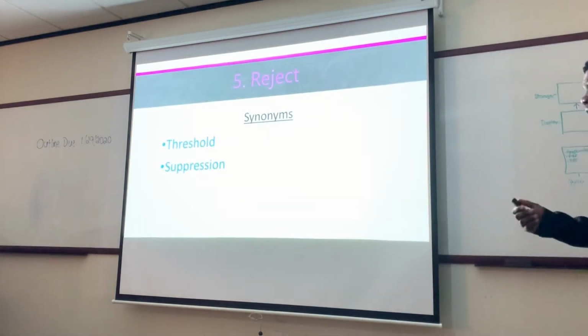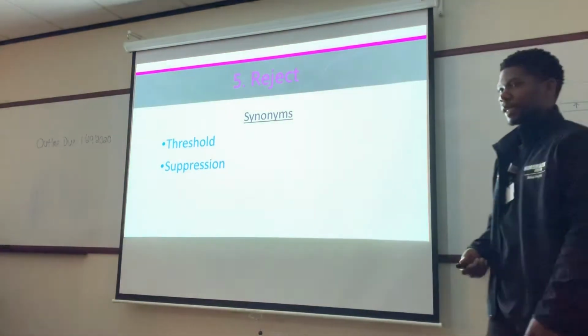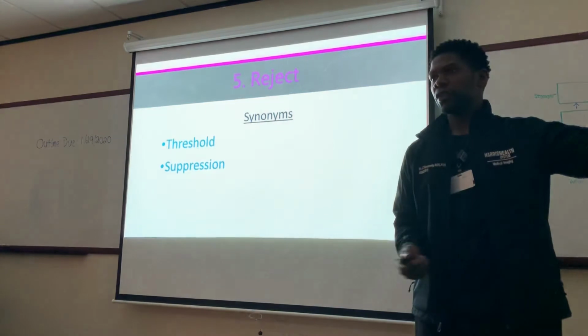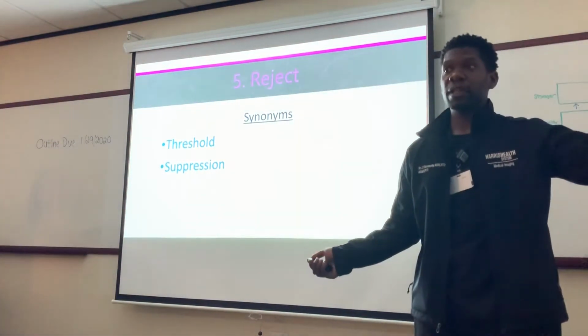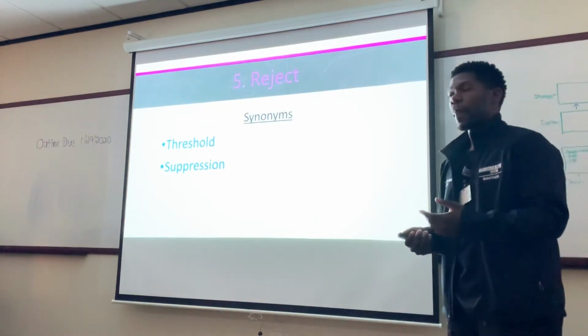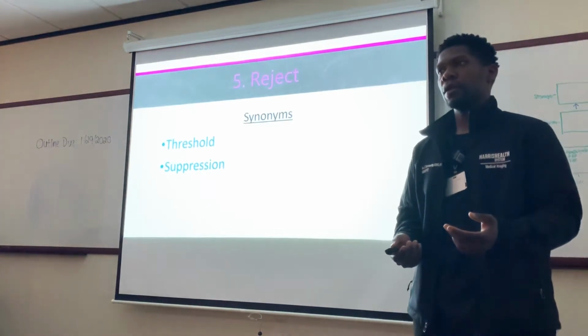So synonyms for that are going to be threshold and suppression. Again, threshold is actually a button on our IU-22. You can control this by threshold. Some machines are going to have suppression. So that's why it's important that you know these terms according to which kind of ultrasound system you're working on.